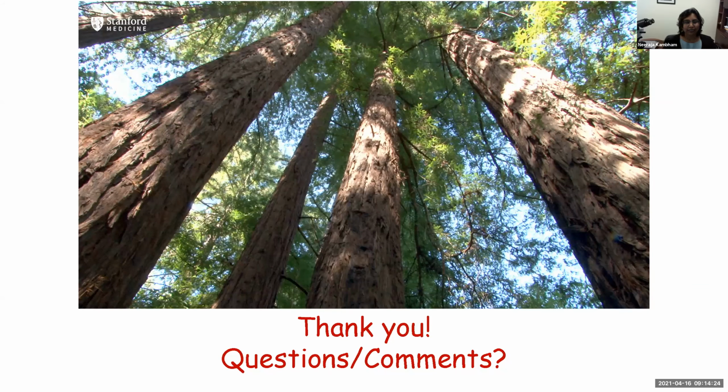Great question. I had some slides. I removed them because I just didn't want to go too far from diabetes. So amyloid, I think our stains, even before you go to IF and EM, the stains are very helpful. The amyloid, for the most part, the mesangial expansion, mesangial area tends to be very pale on PAS and silver stain negative, and some grayish color on trichrome. That one I'm not always convinced, because I think it depends upon the quality of the trichrome stain.